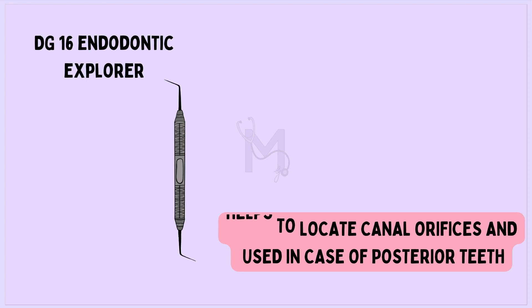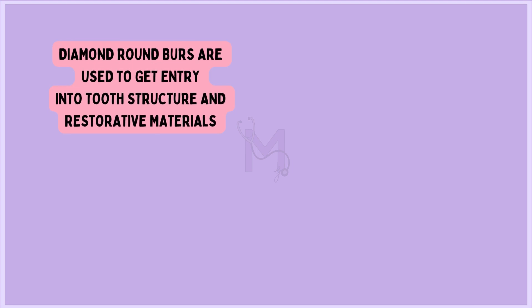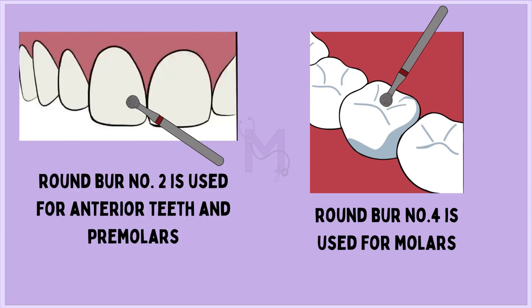Some of the access opening burrs are diamond round burrs, which are used to gain entry into tooth structure and restorative materials. Number 2 and 4 are mainly used — number 2 is used for anteriors and premolars, and number 4 is used for molars.